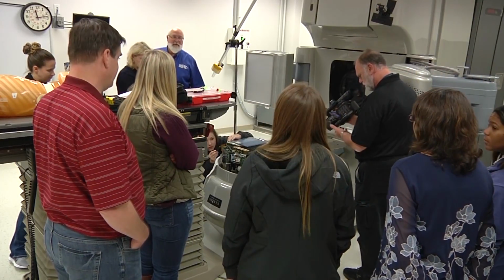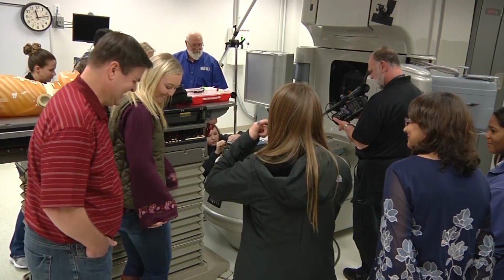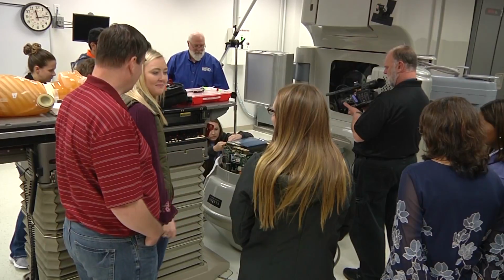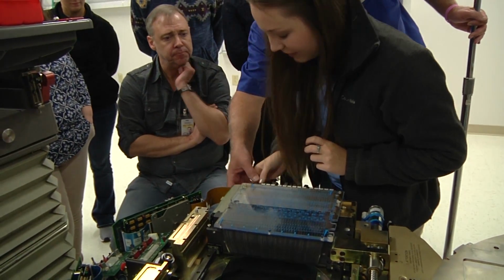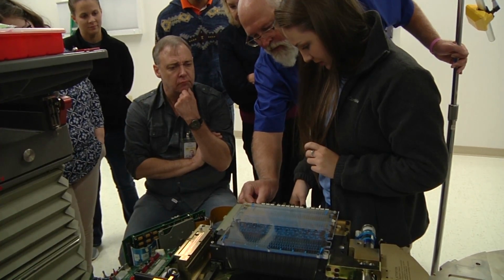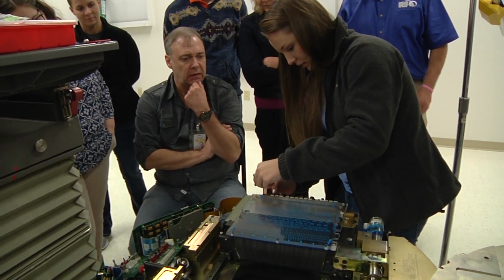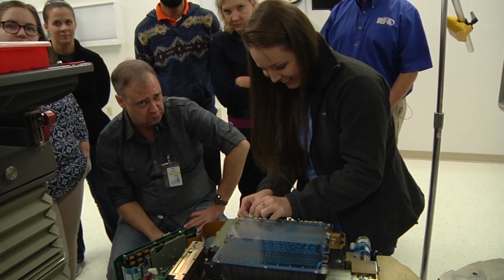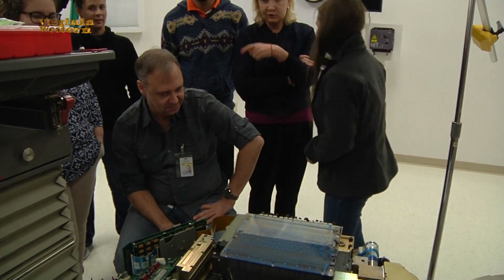So did you put it back in? And the screw? You're saying if you turn it a bunch, it'll move eventually? Yeah, so you'll take it and you'll pull it out. You kind of have to rock it to find that. There it is. You'll find a groove that goes into it. Who wants to go next on this side?